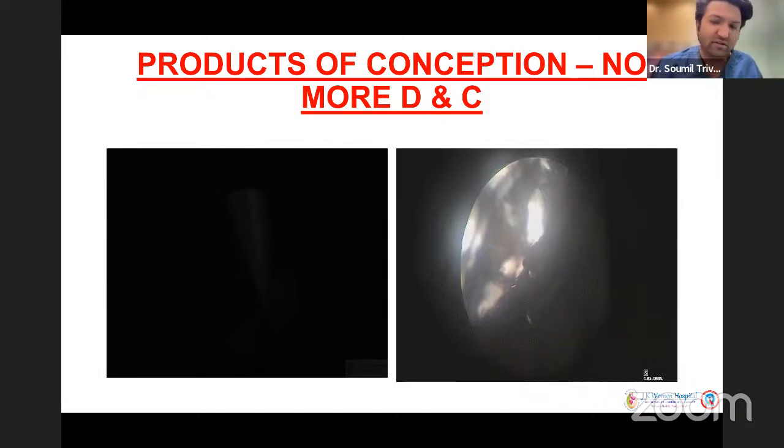I don't think so, sir. I think ultrasound guidance is good enough. Monica, yeah. Sir, I think hysteroscopic removal of products of conception maybe we can do in private setups, but in the large community setup, it's not feasible. There, it's better you do a careful curettage under ultrasound guidance, because nowadays everywhere you have an ultrasound machine. Keep a partially filled bladder, put an abdominal probe, your assistant holds it, and you can easily guide. This is for the basic setups, but ideal would be hysteroscopy.